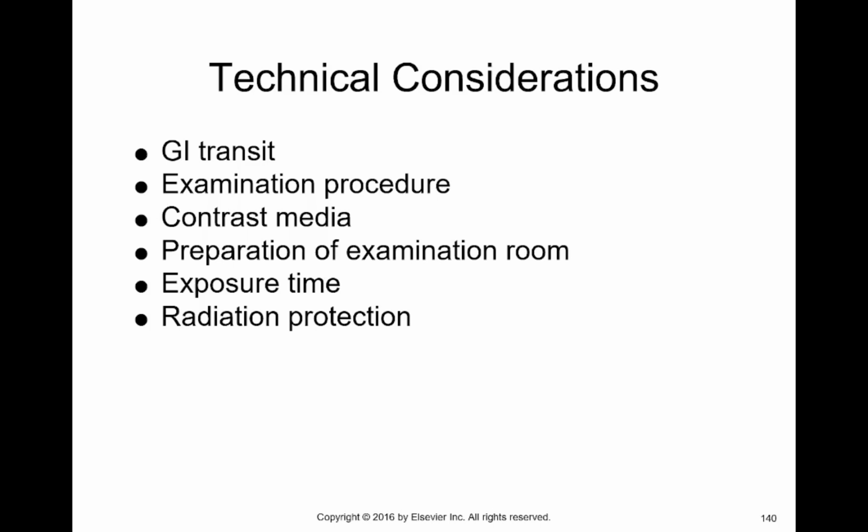You would want to present that examination to the radiologist, send them that individual x-ray, and ask them if they want to use iodinated contrast at that point. So your procedure then is pretty much just going to be KUBs. So for that reason, most of the time, this is the first contrast study that you learn to do because it's just KUBs. There are some positioning variances.